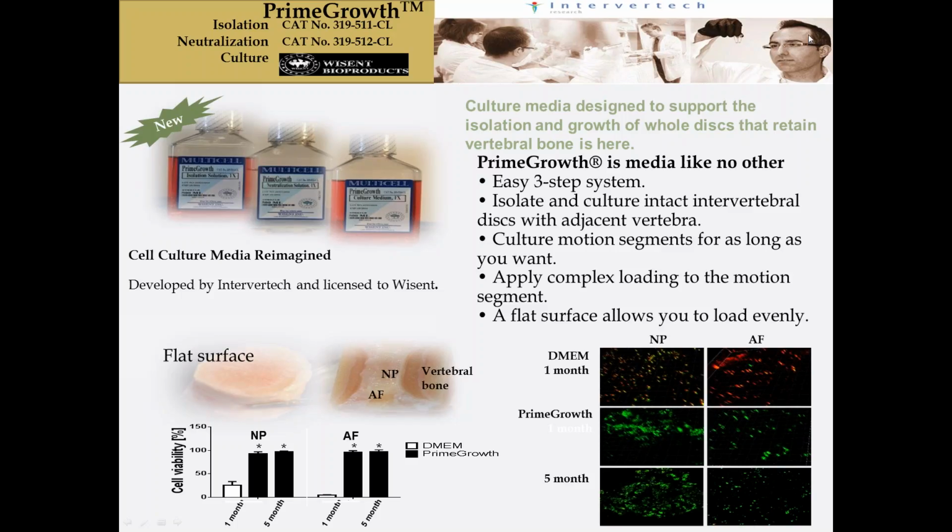So we have developed this with a very easy step. All you have to do is take the whole motion segment, put it in one of the isolation media for just an hour, and you take it out, and it's done. It's ready to be cultured. And we also developed a media where you can culture that, which has taken into consideration the history of the disc. What does the disc require?